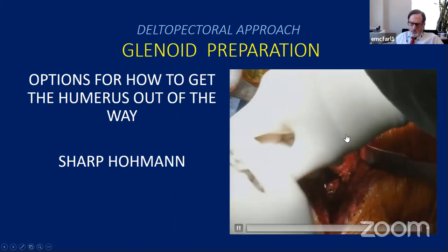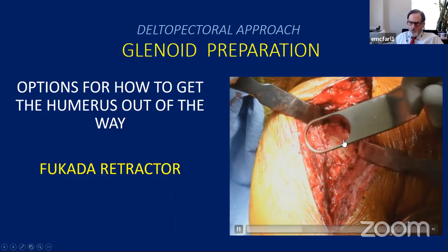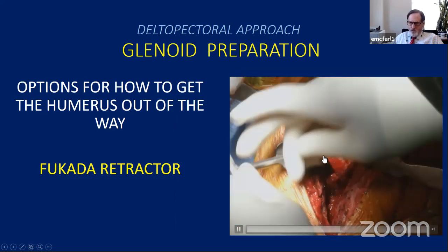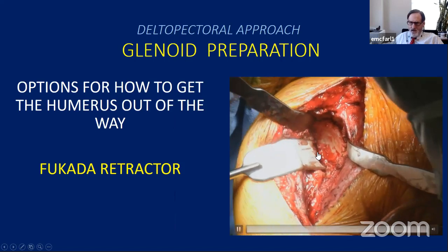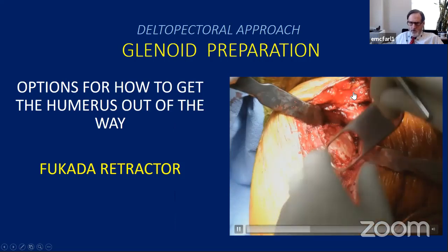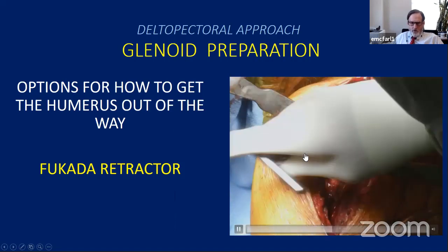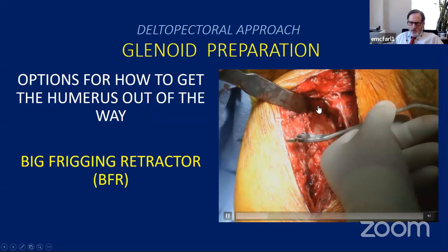Whatever. The other thing you can use is a Fukuda retractor. I personally don't like this very much because the tines are up against the glenoid and the reamers tend to hit these tines. So it's a little harder to use. Fortunately, this is the only plug I'm going to put in for anything: Stryker has this retractor that they designed that has sort of, these are off at an angle.